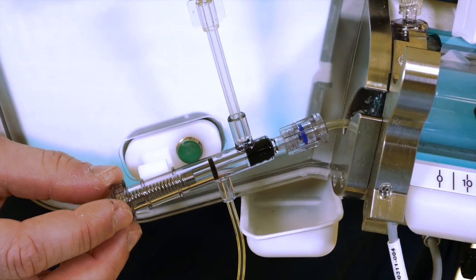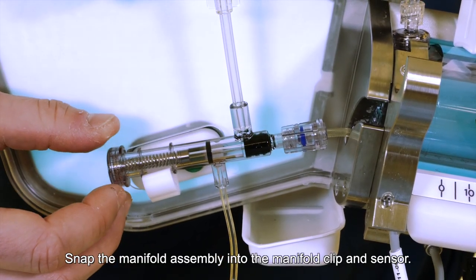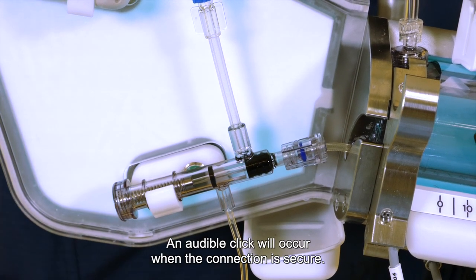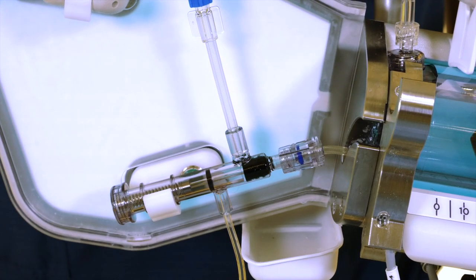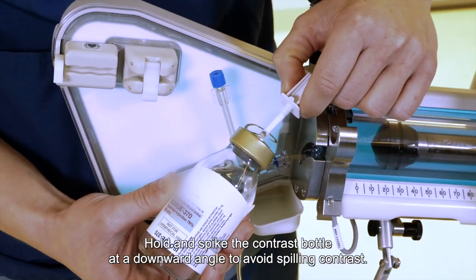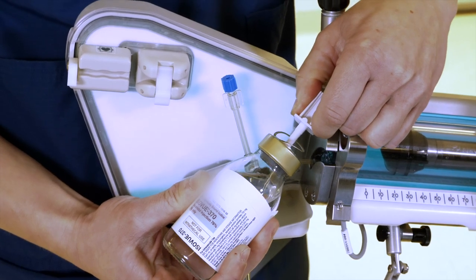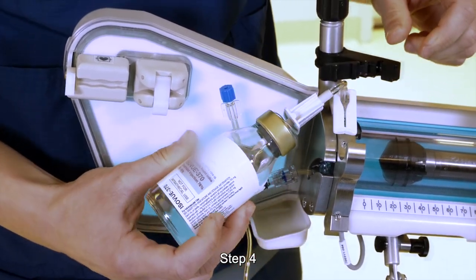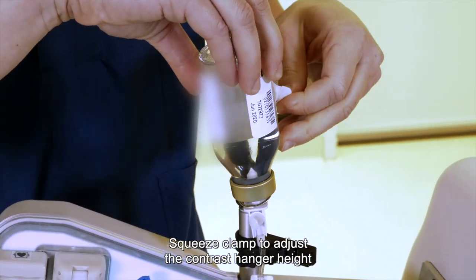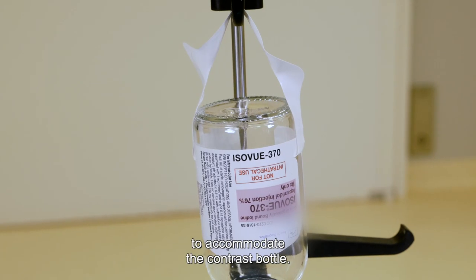Step 2. Snap the manifold assembly into the manifold clip and sensor. An audible click will occur when the connection is secure. Step 3. Hold and spike the contrast bottle at a downward angle to avoid spilling contrast. Step 4. Place the contrast onto the hanger. Squeeze the clamp to adjust the contrast hanger height to accommodate the contrast bottle.